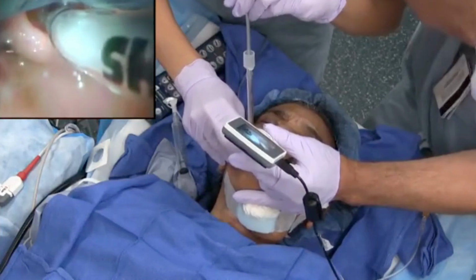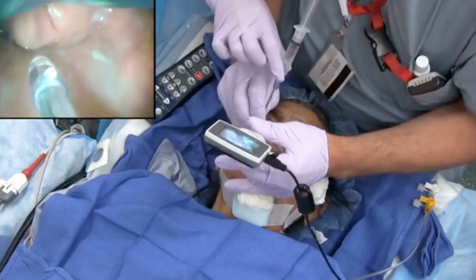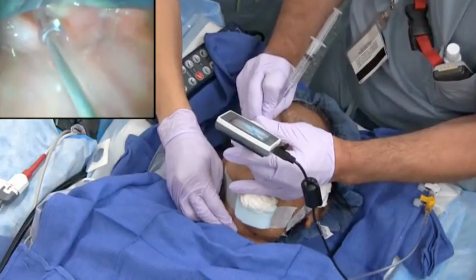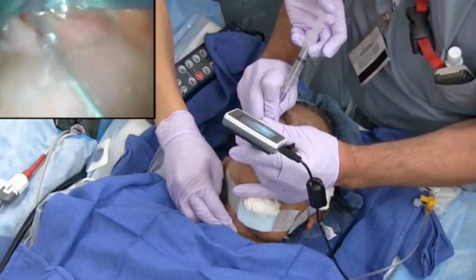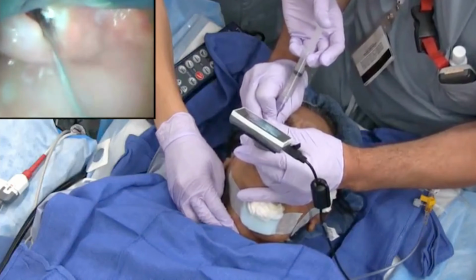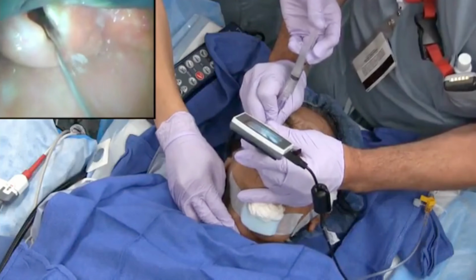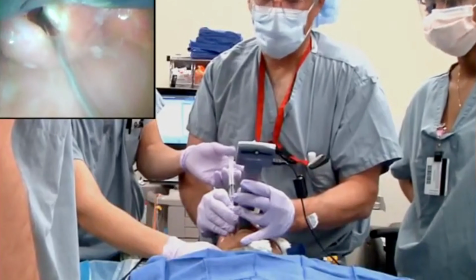Once the tube passes the cords, advance it until the cuff is just beyond them. Inflate the cuff. Ventilate the patient. Confirm placement with chest rise, auscultation, and end tidal CO2. Video laryngoscopy improves visualization, especially in difficult airways. But it introduces a new challenge. Hand-eye coordination becomes critical. A perfect view does not guarantee a successful intubation. Technique still matters. And when blood, fog, or secretions obscure the camera, this approach can quickly fail.